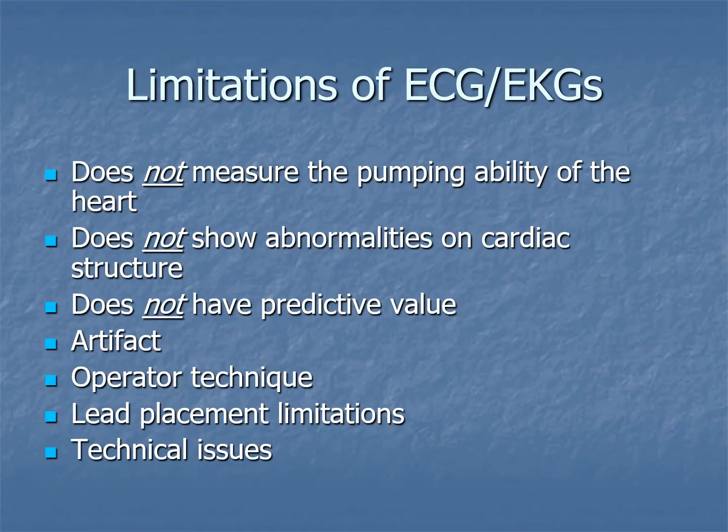Like all diagnostic procedures, ECGs or EKGs also have their limitations. They do not measure the pumping ability of the heart. In order to do that, you need other sorts of interventions, cardiac ultrasound being one of them. But there's also some of the newer technology we have.